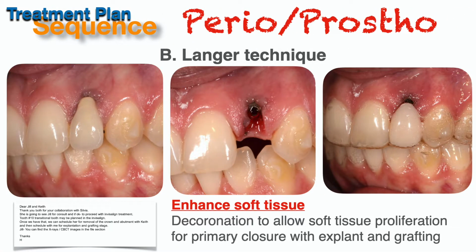So the next step is how we get the soft tissue back. The first thing, before really any attempt at bone tissue regeneration, is removing the restoration and allowing that soft tissue to regenerate. Why is that so important? What is it going to give us? The soft tissue is really the key to closure of our planned bone graft. We need good quality, thickness as well, tension-free primary closure. Yep. So that tissue is going to be everything, not only in terms of the success of the implant, but also the aesthetic balance of the gingival line and everything else we're working on.